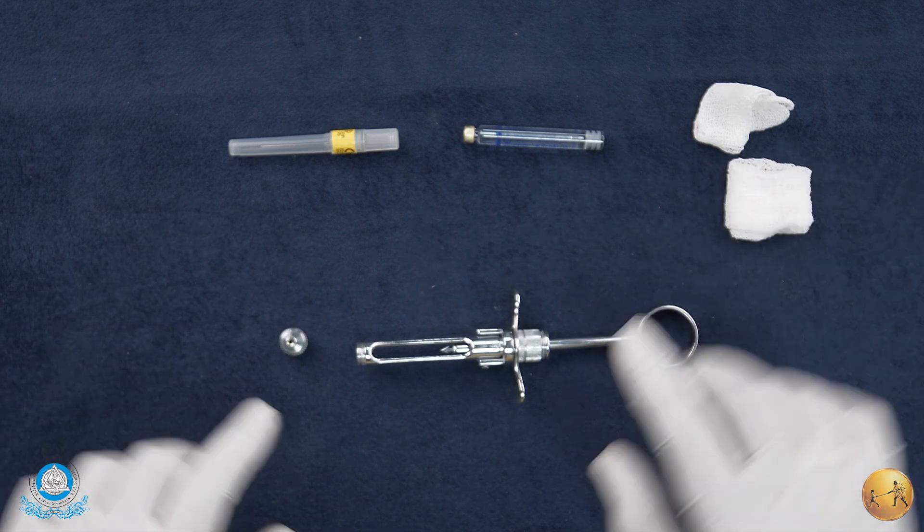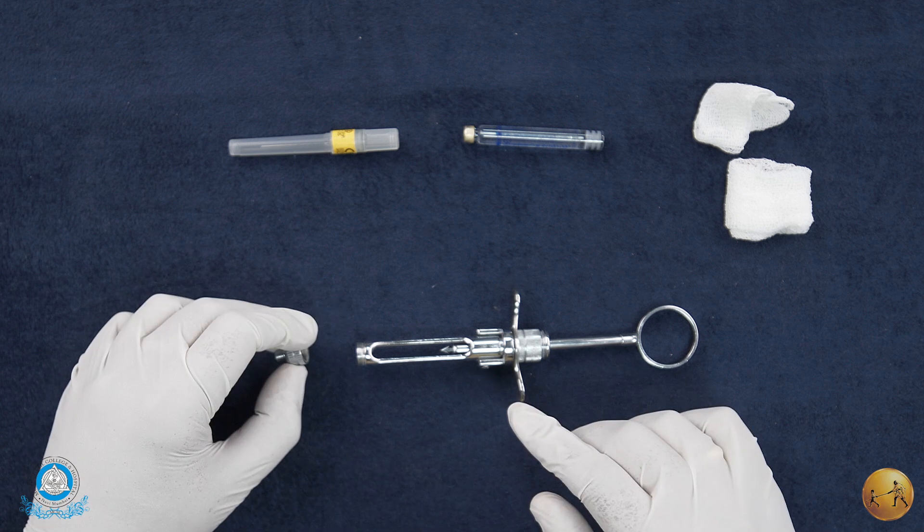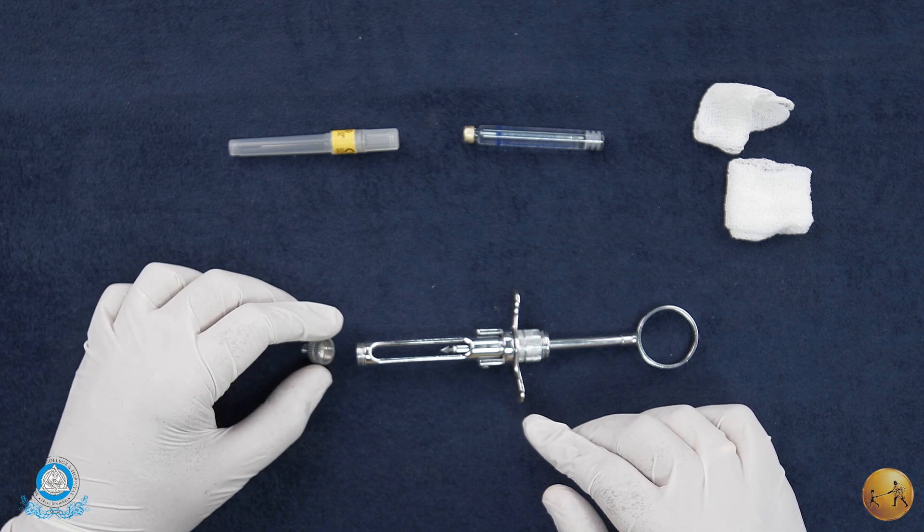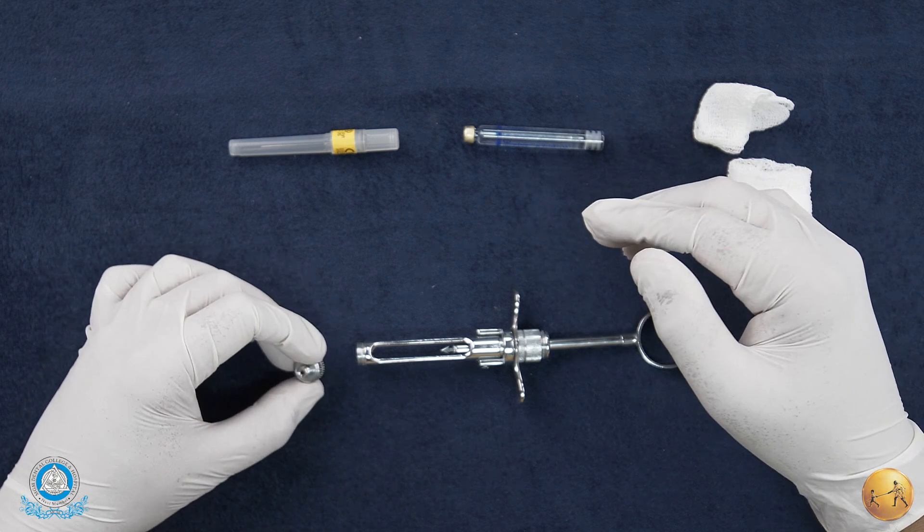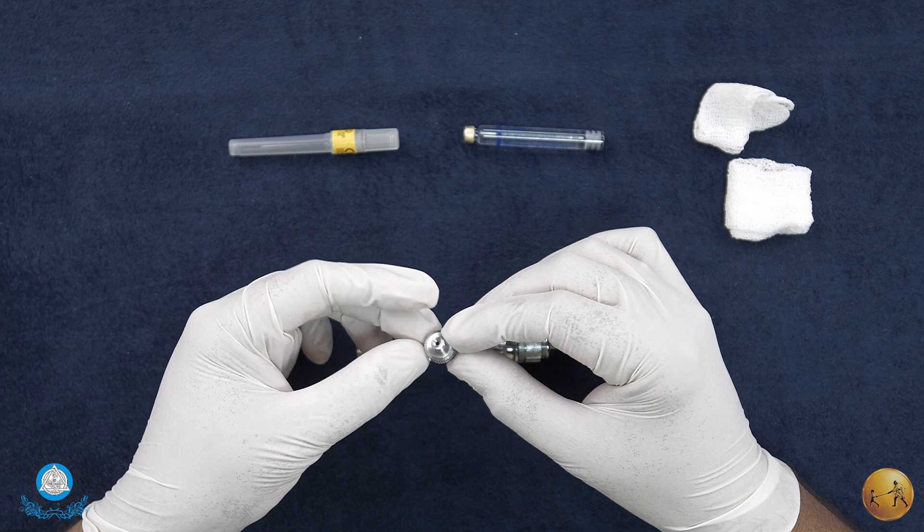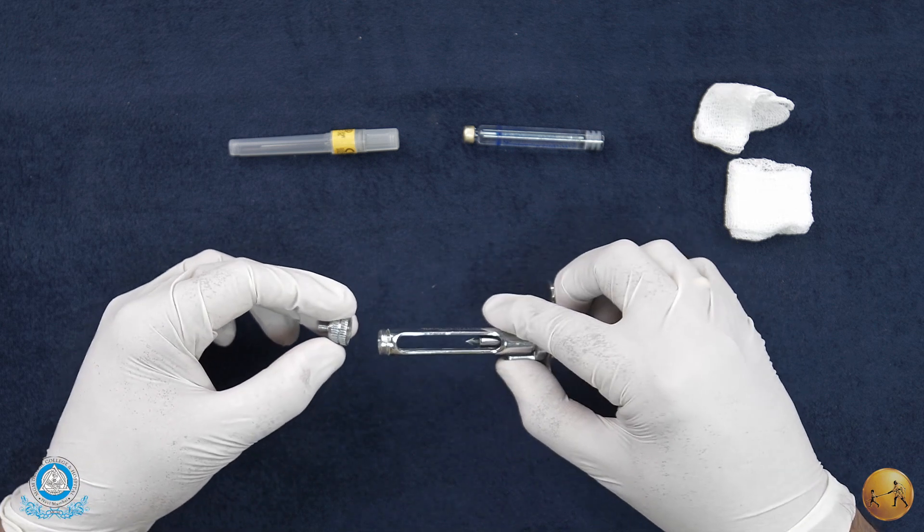What you see here is a breech loading syringe - it could also be used as an end loading syringe, I'll show you how that works. This is the needle adapter - this is what goes on to the syringe at the front which also accepts the needle.